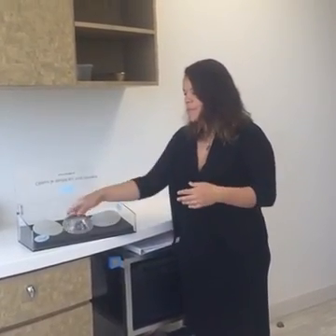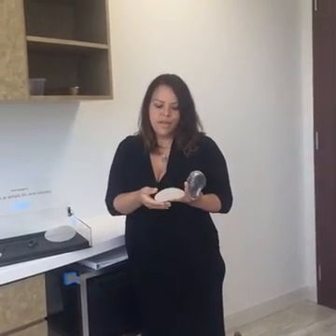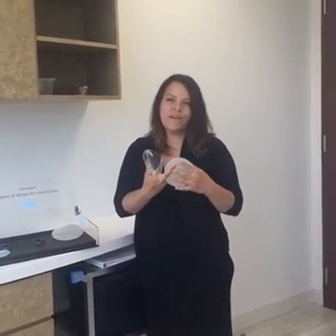The last really important thing is the texturing on the surface of an implant. So again, I'll show you two implants. One implant here is smooth and one implant is textured. That refers to the surface of the implant. The surface of the implant can either be a nice, smooth, very mobile surface, or it can be textured. The texturing is a little bit like gentle sandpaper. The idea behind the texturing is that it helps to hold the implant in place, or it helps it to stick almost a little bit like a Velcro.